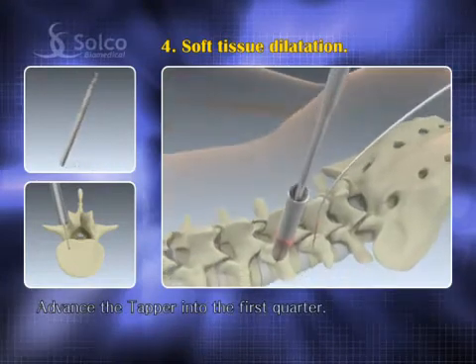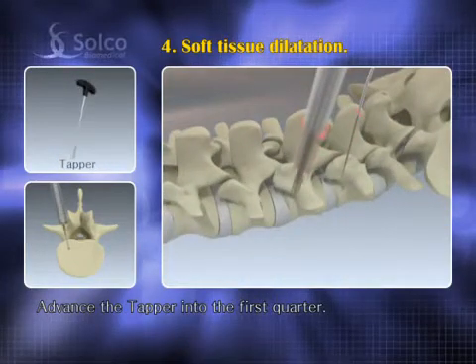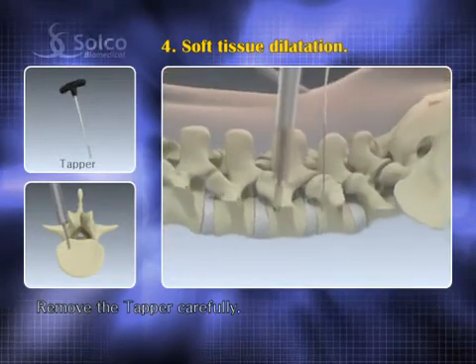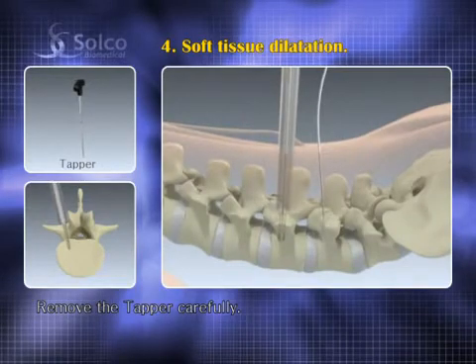Slide down the tapper over the guide wire and advance it up to the first quarter of the vertebra. Remove the tapper carefully to avoid any unintentional withdrawal of the guide wire.